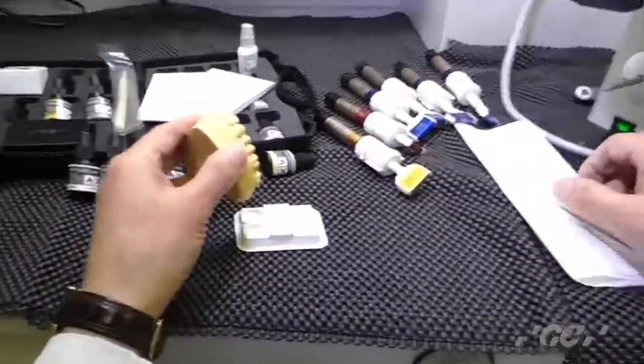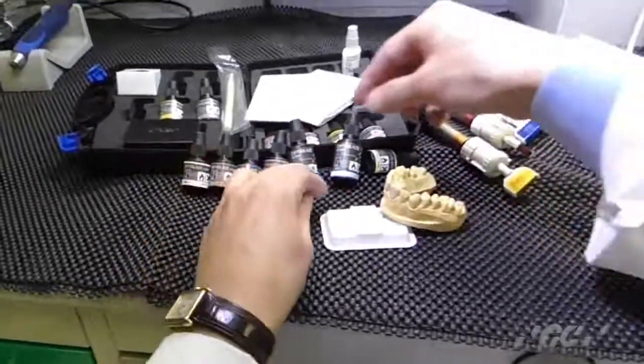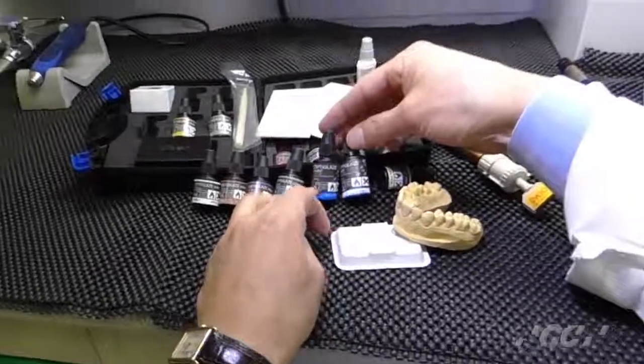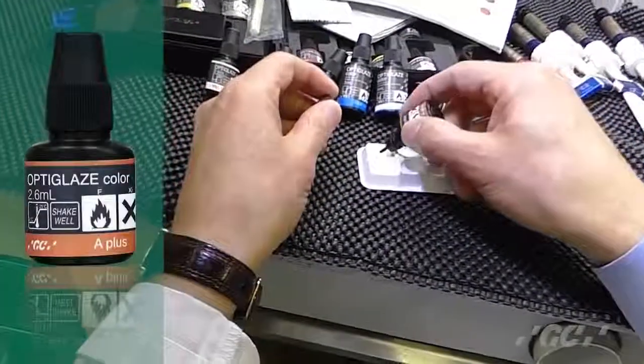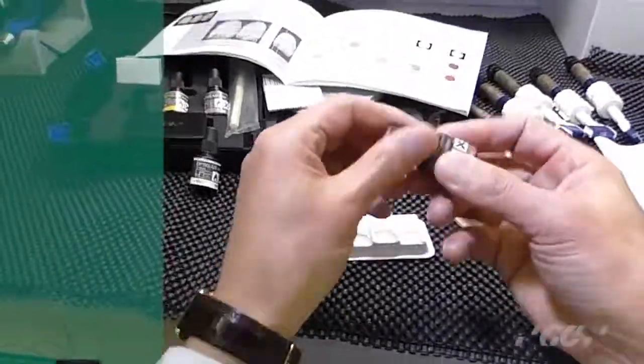If you decided to use it, you don't need to apply any clear — just color only. You can use any color you want. I like to have a little bit of orange, a shade, a plus shade. Shake well.